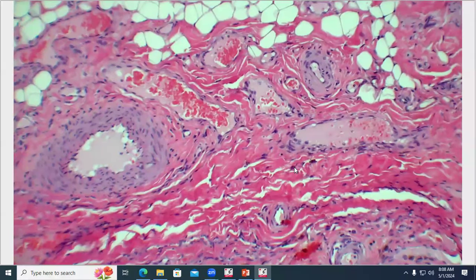These features, if we had uveal necrosis, it would be even better. There isn't really convincing uveal necrosis in section. However, there's a lot of distortion in the uvea from buphthalmia. So retinal necrosis, uveal necrosis, a mixture of hemorrhage and very high protein fluid inside the eye, and then seeing this high protein fluid in the vessels is suggestive of a condition called hyperviscosity syndrome. So basically this is a condition that occurs in any of a number of underlying conditions that result in a higher viscosity blood.